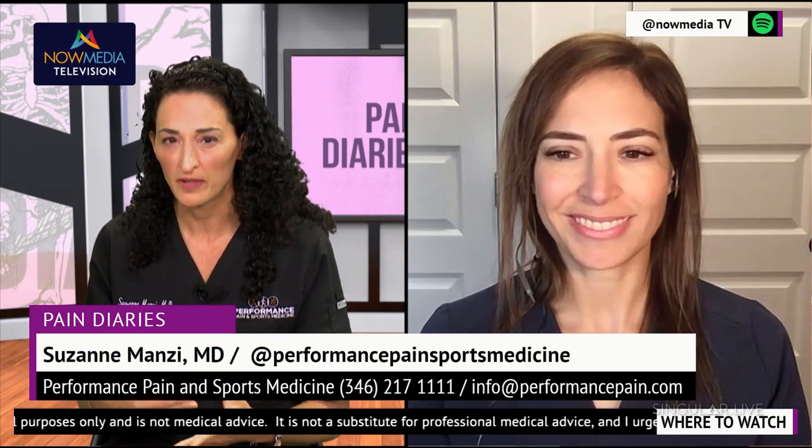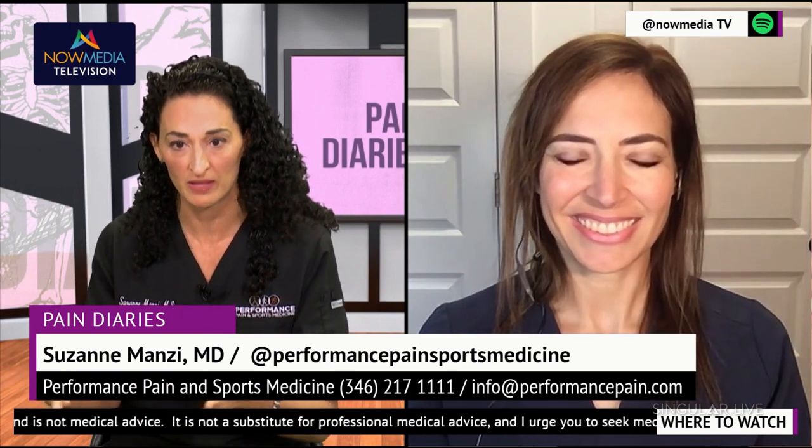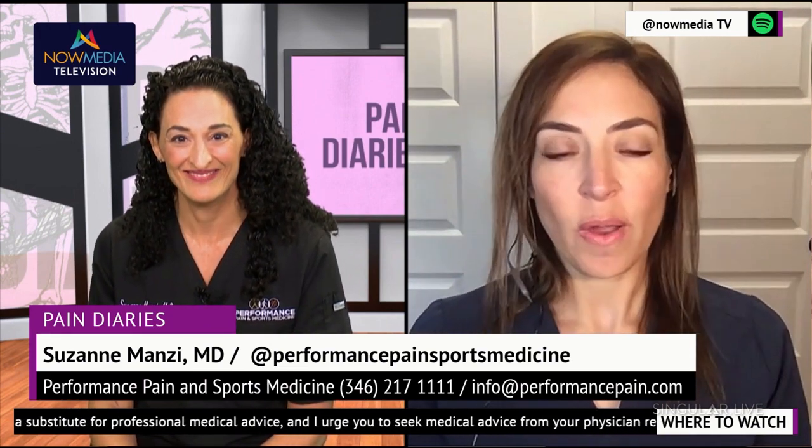Absolutely. What are some of the other things that you determine a patient to be a good candidate for spinal cord stimulation? What do you look for? Really great question. So I'm thinking about spinal cord stimulation for a lot of my patients. I don't necessarily think that every patient needs to have a device implanted in them. Let's be honest, I'm not the Oprah of spinal cord stim, like you get a stim and you get a stim. But I think, if patients are looking for a really elegant way to control their pain that doesn't require a lot of input, doesn't require a lot of intervention with the frequency that taking a medicine does, or having multiple injections on multiple basis, the recovery is really short.